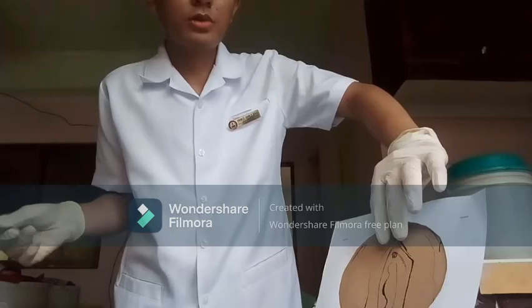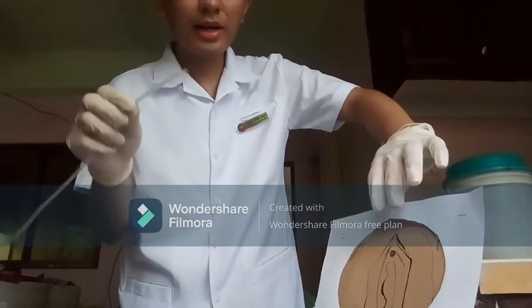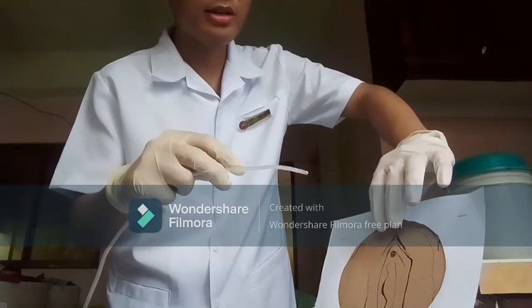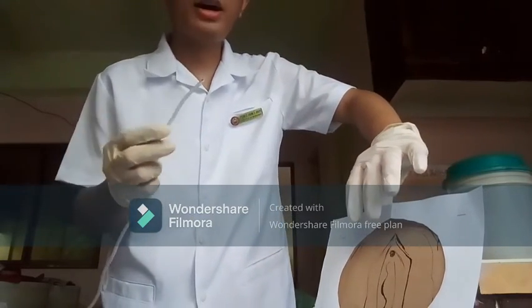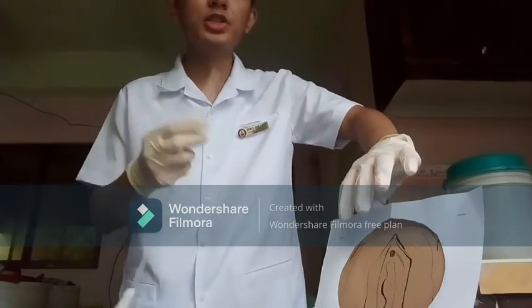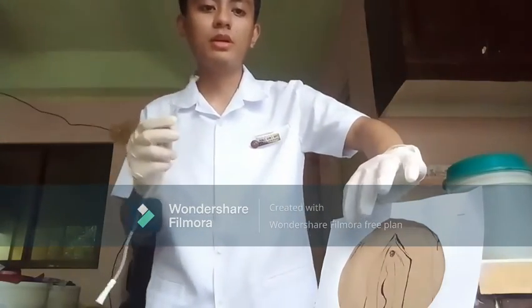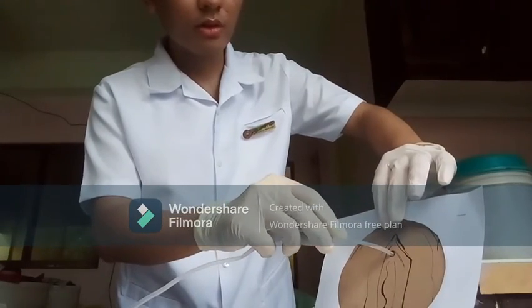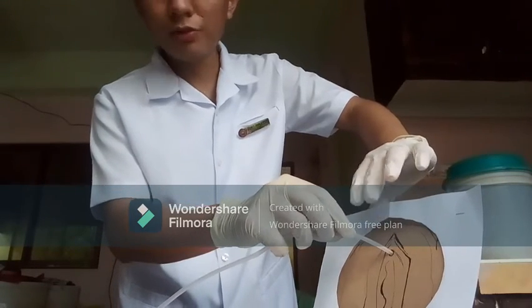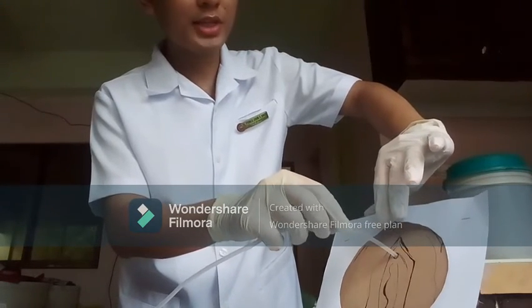urethra to properly insert the catheter. I have already lubricated this catheter. So I want to insert the catheter into the urethra, and now we will instruct our patient to inhale and exhale. When she inhales, it serves as the instruction, and when she exhales, that is the time that we insert the catheter. If you feel resistance, we will just continually instruct the patient to inhale and exhale. So inhale, exhale, ma'am.